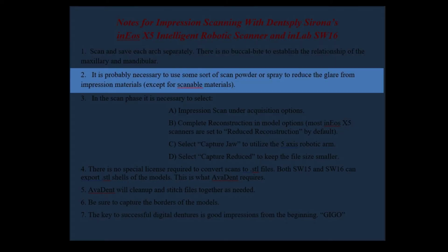2. It's necessary to use some form of spray or powder, whichever brand you like. It doesn't have to be OptiSpray. Whatever you're used to using. The key is don't cake it on. Keep it thin so that you get a good fit.